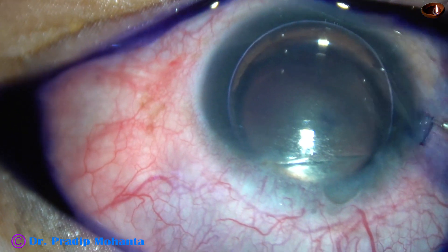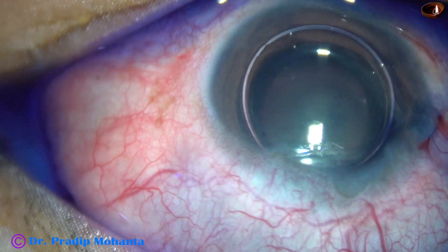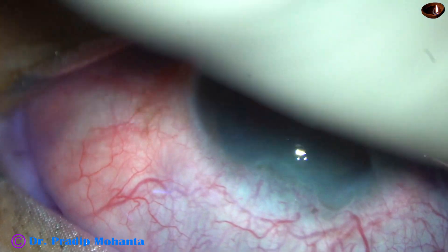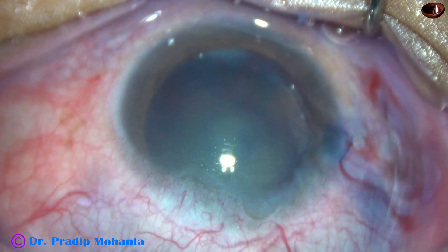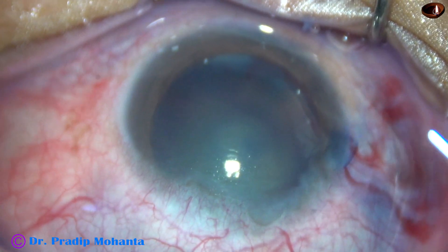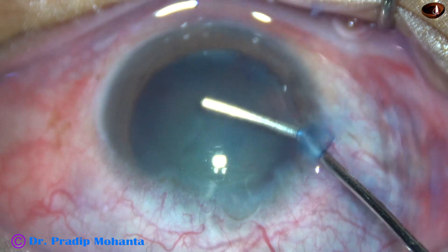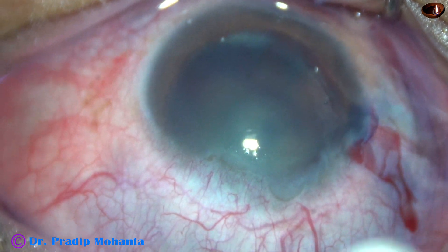An air bubble has been injected beneath the capsule. Trypan blue dye is applied over the anterior capsule. The dye is washed out, and then the anterior chamber is filled up with 2% hydroxypropylmethylcellulose. And now capsulorrhexis is to be done.